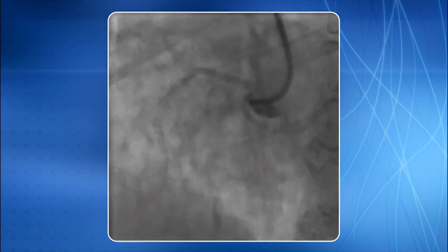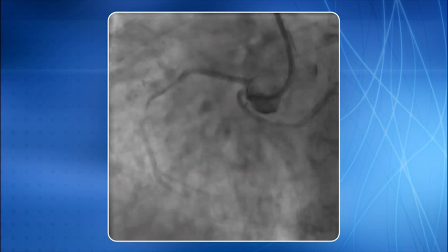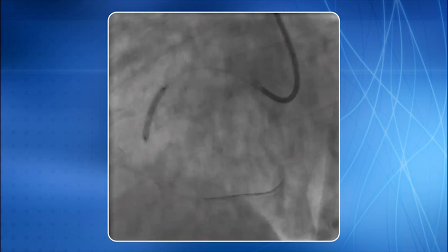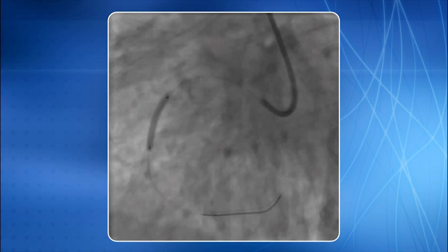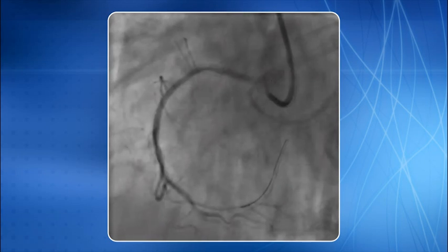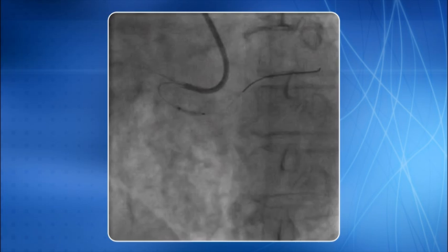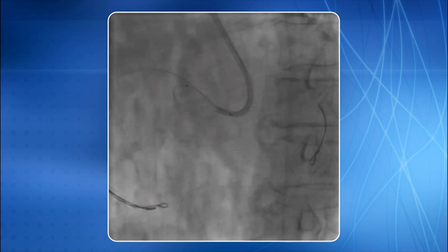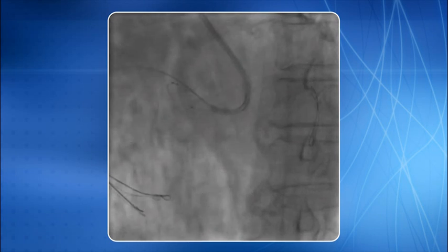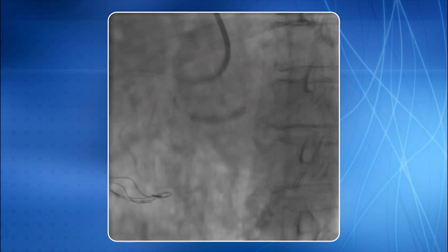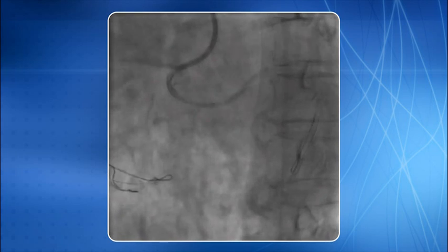This is an example of anomalous origin of the left circumflex artery from the right coronary cusp. The RCA intervention is in progress and the end result is revealed. The LCX intervention is then performed, the stent is placed, and the final result is shown.